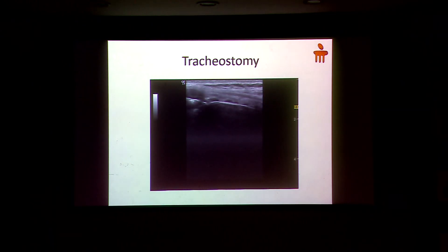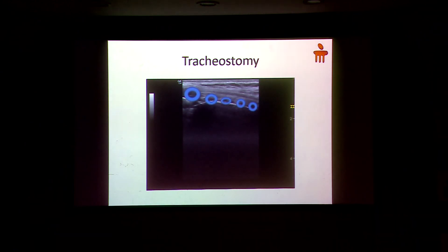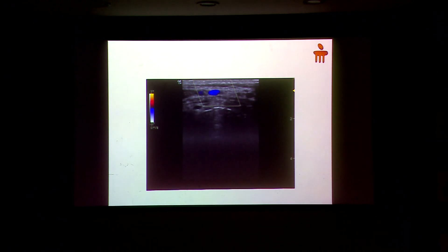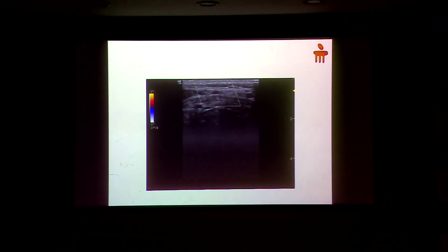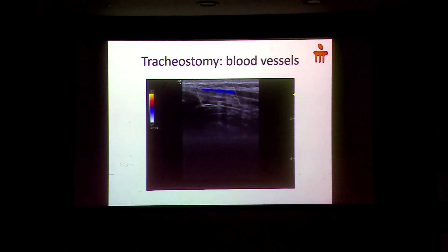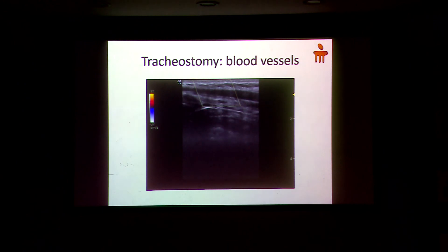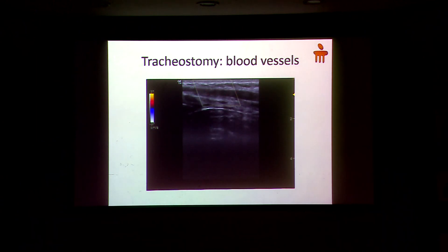Another use is guiding tracheostomy. You can identify the tracheal structures — this is the trachea and these are the tracheal rings — and decide exactly where you want to go, between the 1st and 2nd or 3rd and 4th rings, depending on where blood vessels are located. You can see the blood vessels as well. If a vessel is in the midline, you know you cannot put your needle there and must find an alternative site. For example, one patient had a blood vessel running in the midline — that patient would be sent for open surgery so the vessel could be pushed aside, avoiding a major catastrophe.